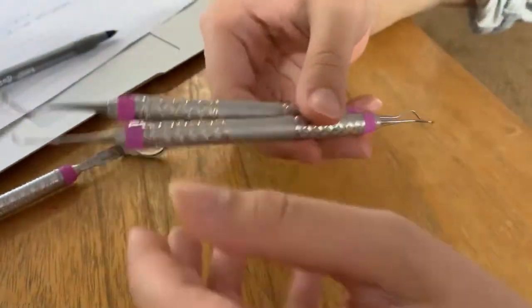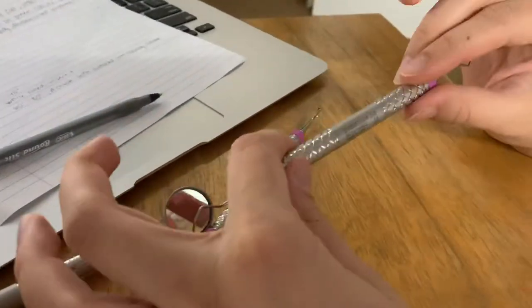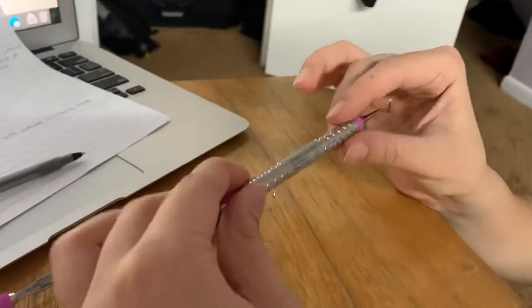Hello guys. Today I'm going to be showing you how to use the two universal curettes. I'm going to be showing you the SC1314, which is the universal Colombian curette, and then we also have the H5 Barnhart.